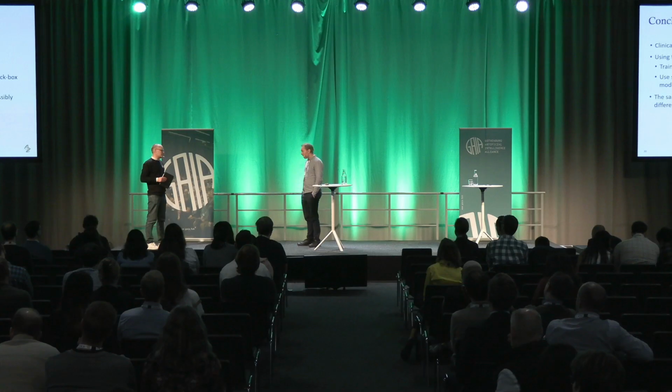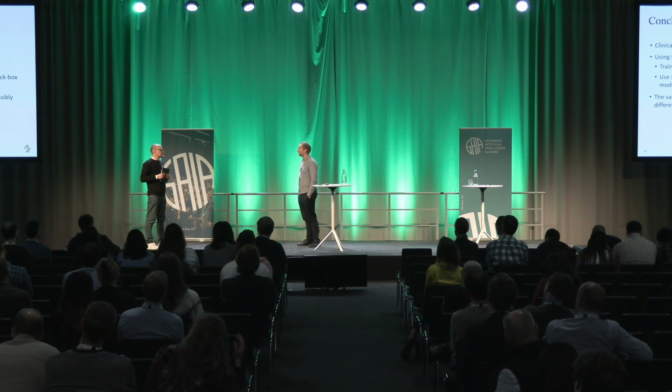So typically they use these segmentations for different parts of the sequence, like the end diastole and end systole, and they calculate the volume for these segmentations. So they will do calculations based on these that they will then acquire the number they're looking for. Okay, to check the health of the heart in order of the volume. In different ways, exactly. And that depends, of course, on the kind of analysis they're performing.